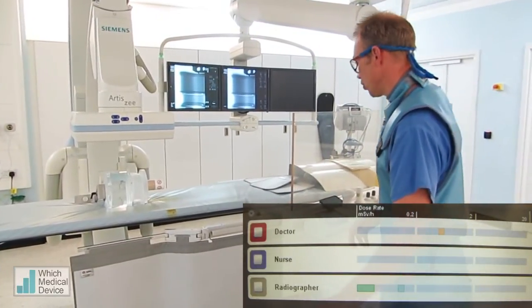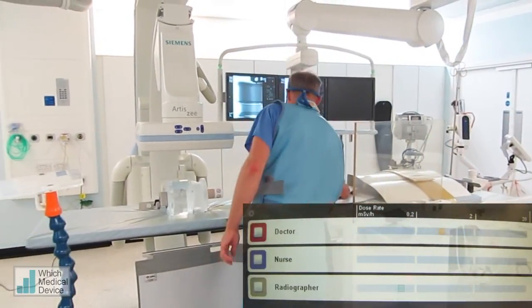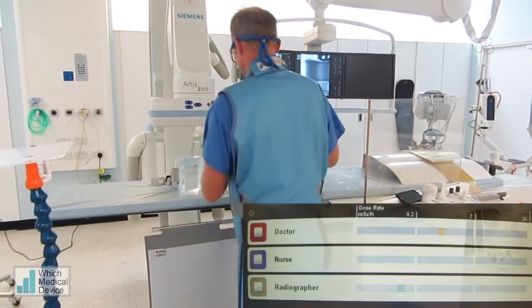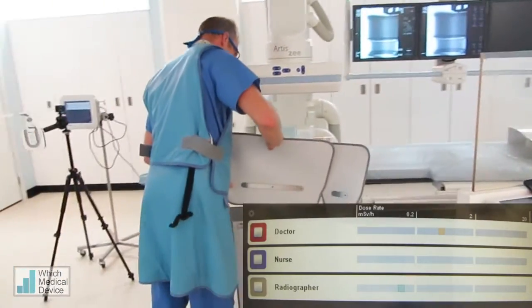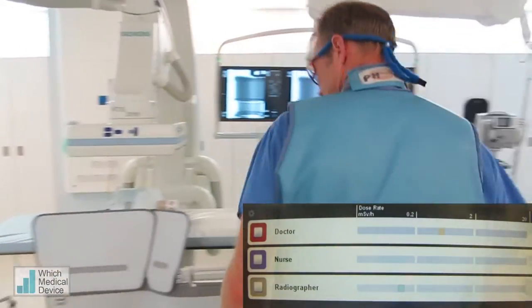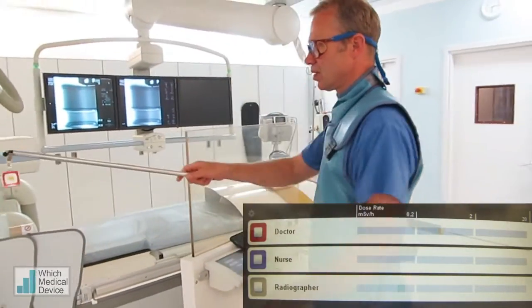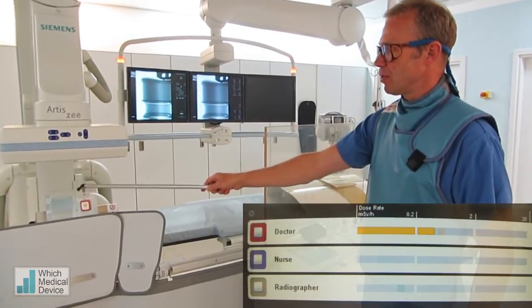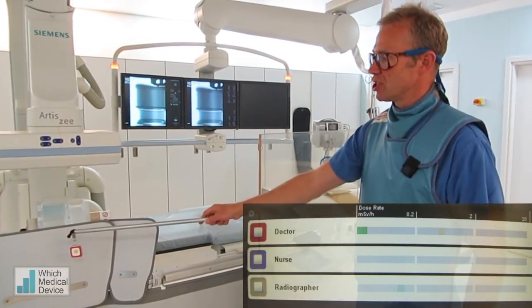That lead screen can be improved even further by adding some additional lead protection a little bit higher up, which will protect you even more from the scatter coming back from the patient. And again, that's going to give you a significant dose above the lead, but when we're coming down behind it, it's going to be virtually zero.